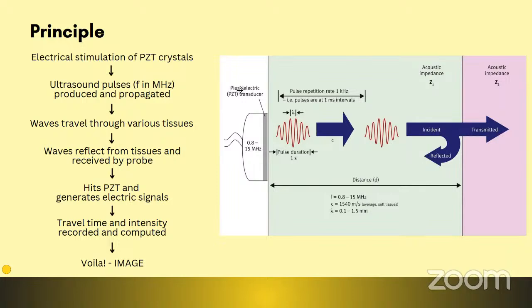So we are dealing with two working principles here. One is the piezoelectric effect and reverse piezoelectric effect. Next is echolocation. And sonar is the instrument, to be more precise. So we'll go into the first step, which is electrical stimulation of piezoelectric crystals.